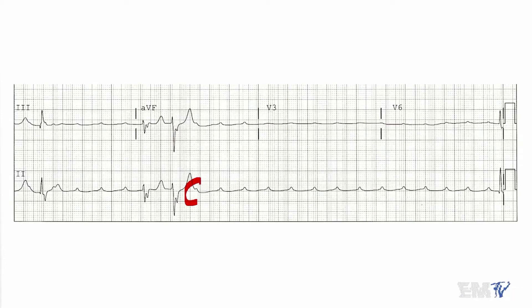The one telltale sign though that makes this definitively a 3rd degree heart block is the fact the P waves are moving. As you can see the P wave is present here right at the end of the T wave of this complex. If I move to the beginning of lead 2, you'll see the P wave is in a different spot altogether. If this were a 2nd degree type II heart block, the P wave location wouldn't change.